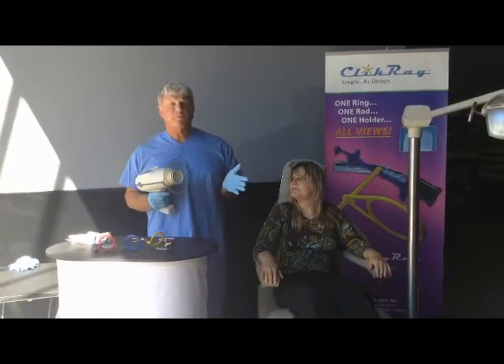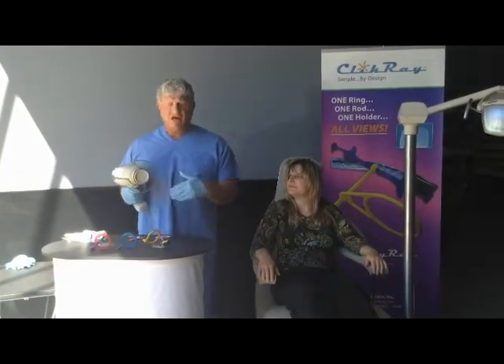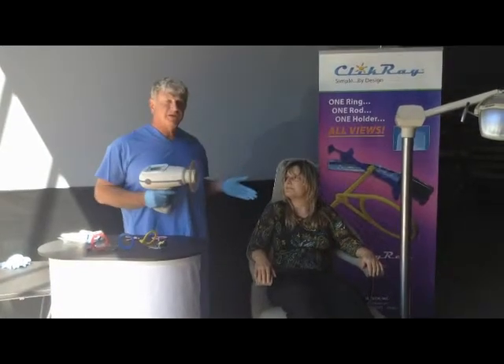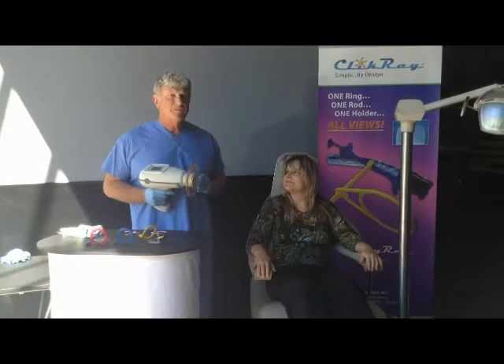Today for demonstration purposes, we're using a unit that is not live. Our sensors are also not live, therefore my patient here will not be wearing a lead apron just for demonstration purposes today.